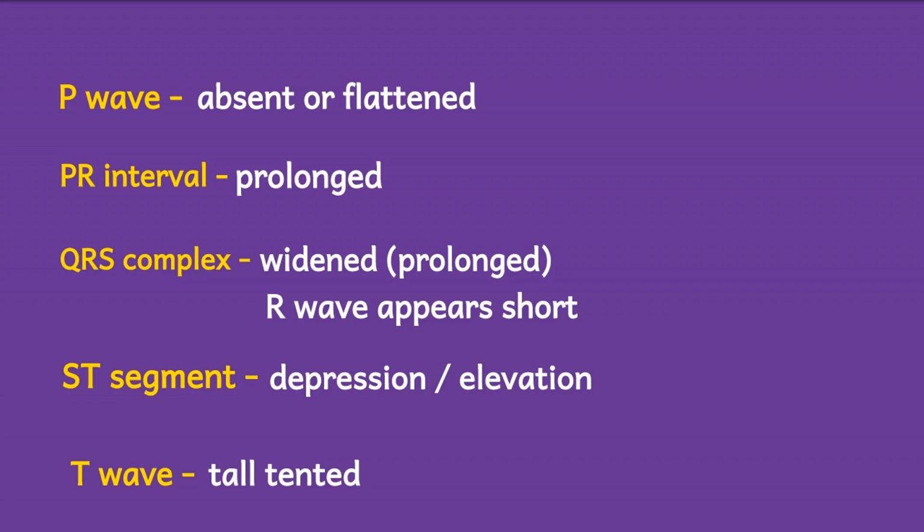And also there is another waveform called the sine waveform. That is also a manifestation of hyperkalemia, and the next slide will show the various changes.